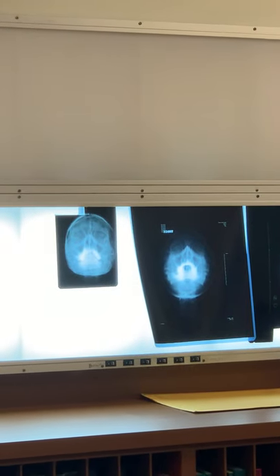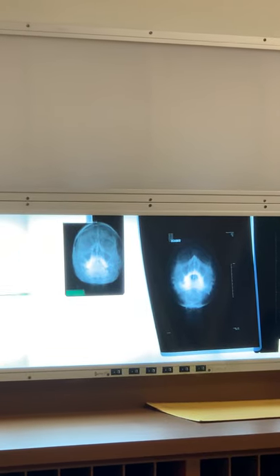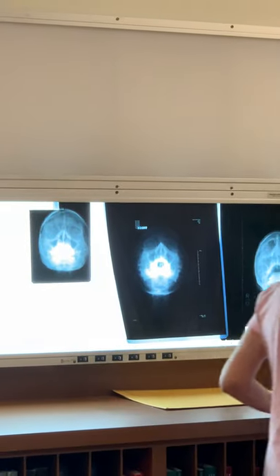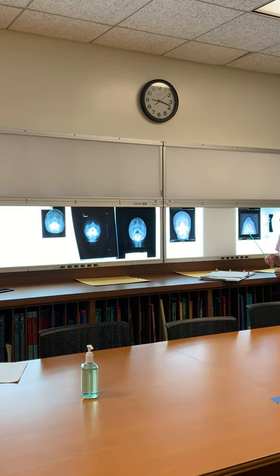What do we look at? The petrous ridges. Yeah, the petrous ridges should be in one horizontal plane. Not bad. Okay. Over here, there's the other Waters. That's the Caldwell. So, correct baseline beam relationship.